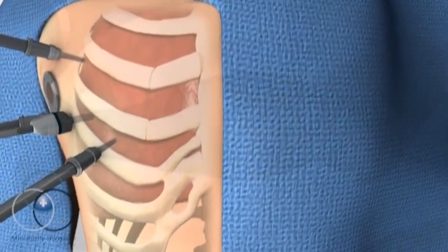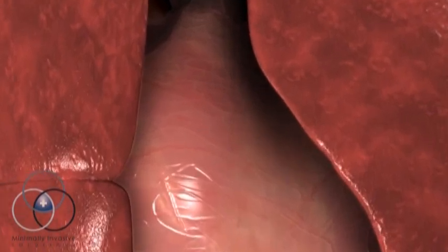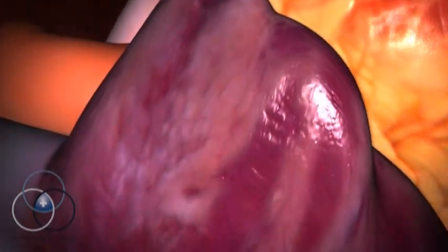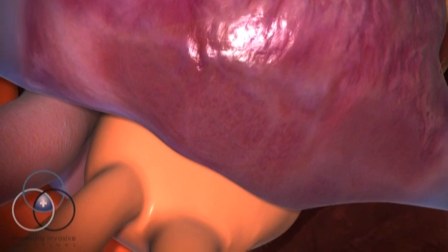Before the surgeon can repair the valve, the patient must be placed on bypass. The surgeon makes a small incision in the groin to attach the bypass machine to the patient. The bypass machine does the work of the heart and the lungs while the surgeon repairs the heart valve.